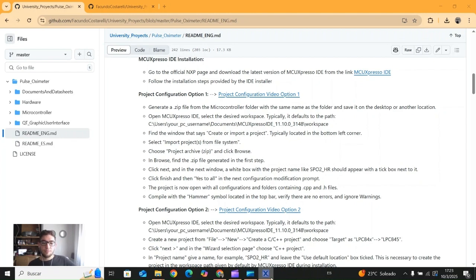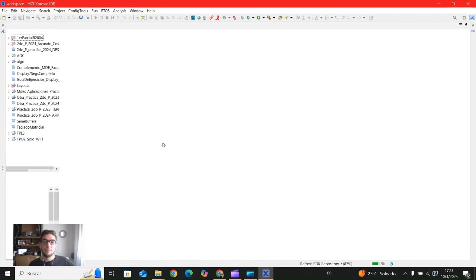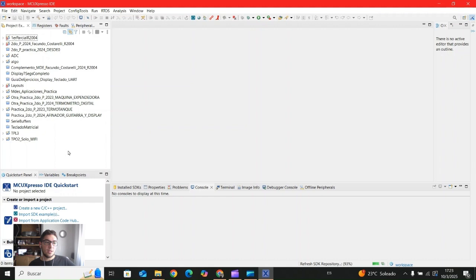So once opened, we close the welcome window. Then we can see all the projects that I already have. This is not going to be important right now. We are not going to use this. Just to mention that you are going to be able to see all the projects displayed here like this.